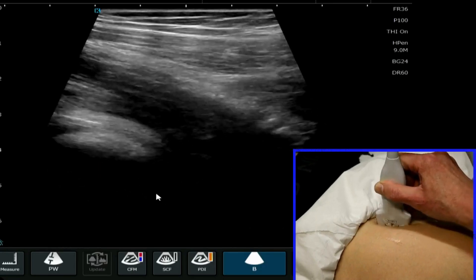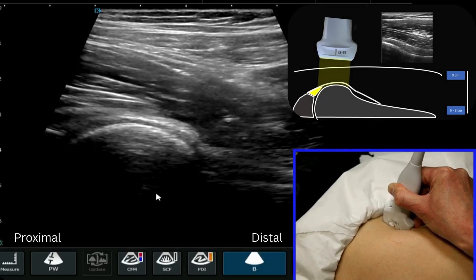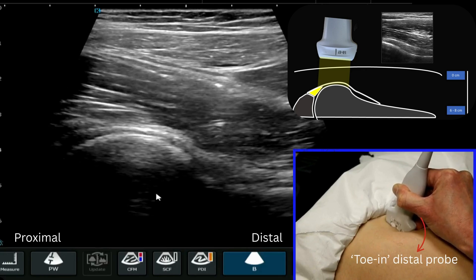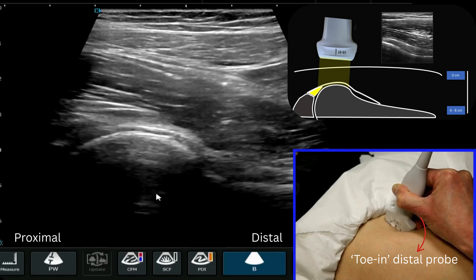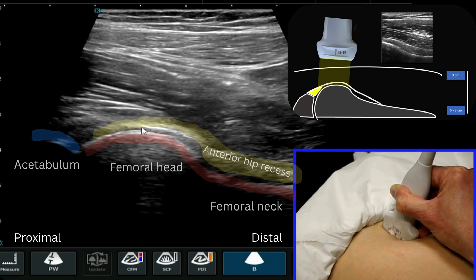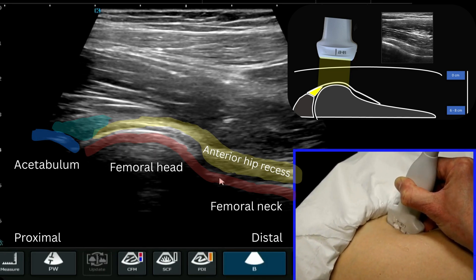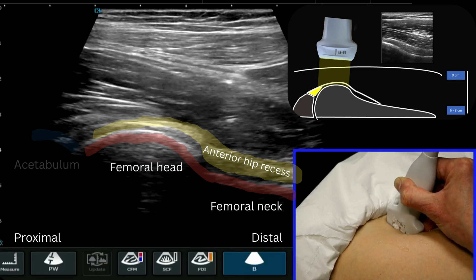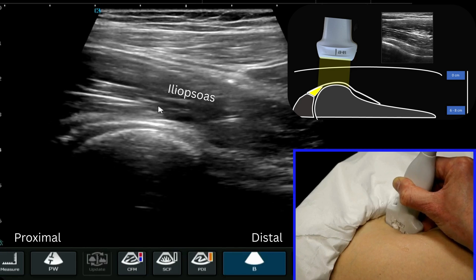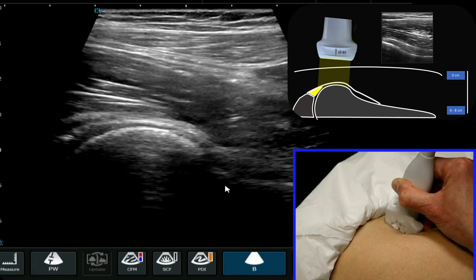We're going to turn the probe, and then I have to dig in with my probe — the distal end is quite firmly planted into the thigh. You can then see the anterior recess of the joint overlying the bony structure: the femoral head, then the neck, and then the anterior joint recess. On top of that, the iliopsoas is very clearly visualized, and that's basically the main features of this scan.